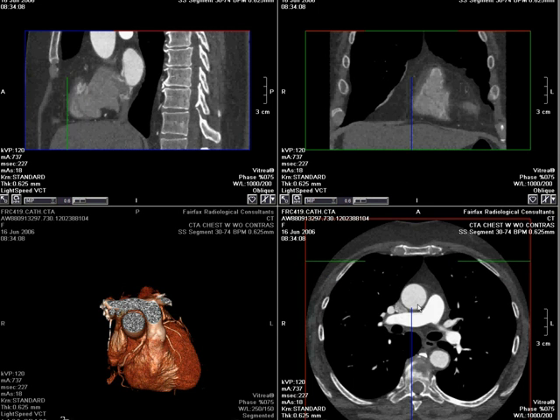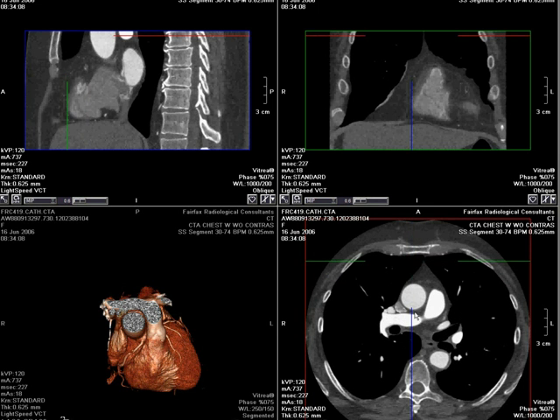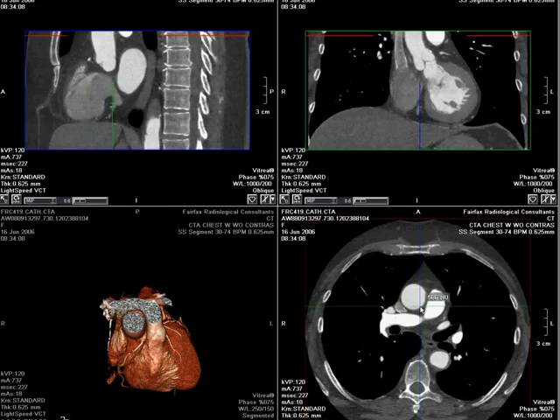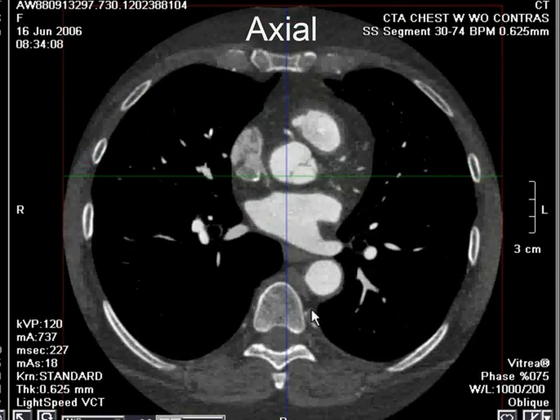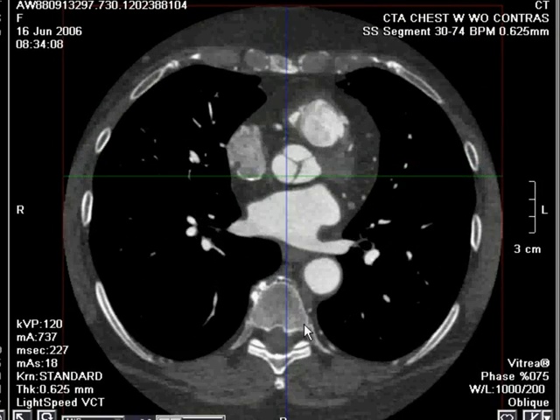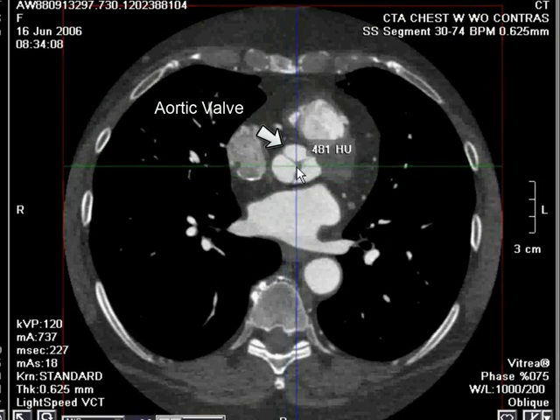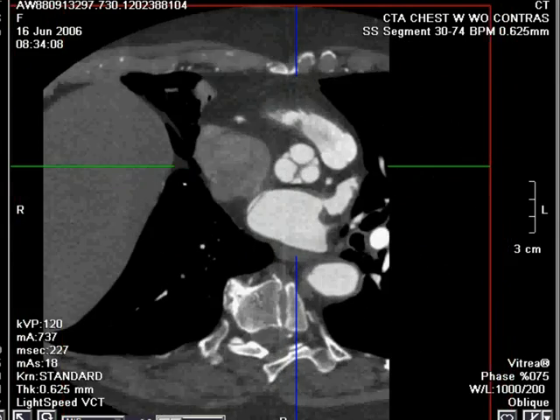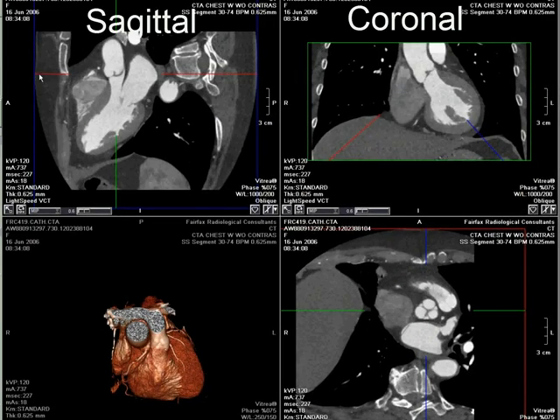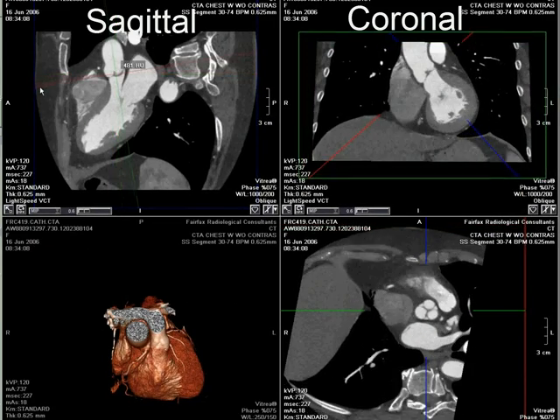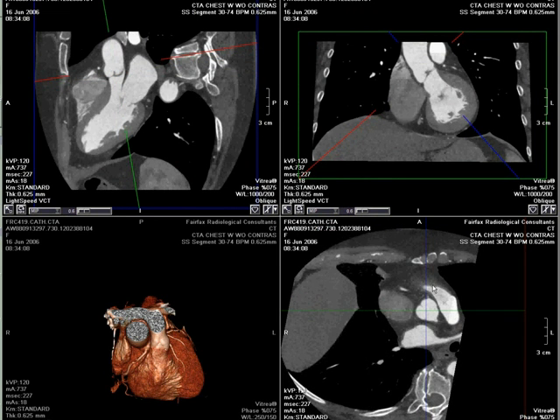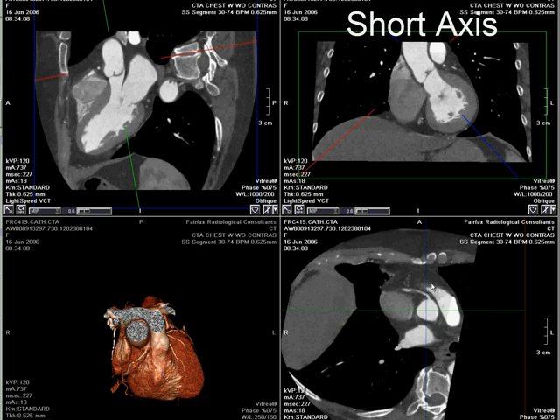The first thing we're going to do is evaluate the origin of the right coronary artery. On the axial images, we are going to head to the level of the aortic valve, and then using our coronal and sagittal images, obtain two long axis views of the aorta, which produce a beautiful short axis view.